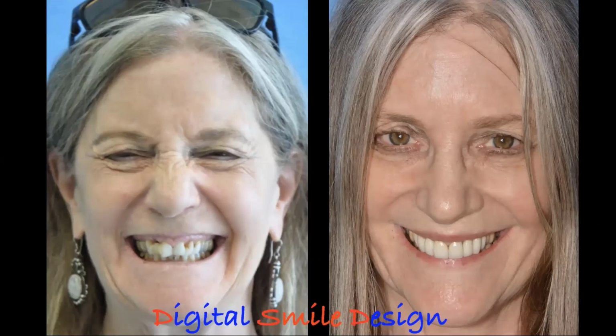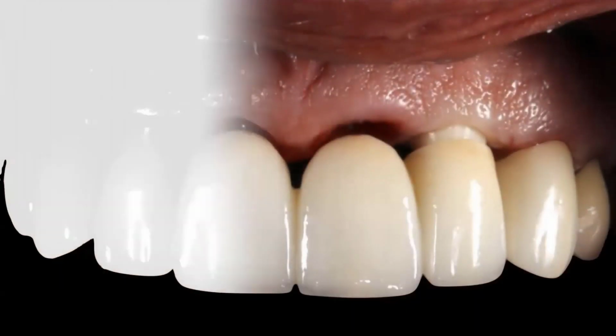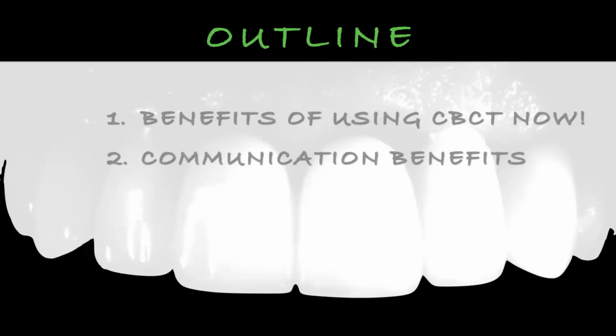And so in digital smile design or digital workflow or communication, being able to use cone beam CT scan technology to communicate to your patients, to understand, so they're part of the journey. You want them to be part of the journey, because if they're part of the journey, they're going to be compliant. They're going to understand how difficult something may or may not be, but they also will be able to say, hey, listen, I get it.